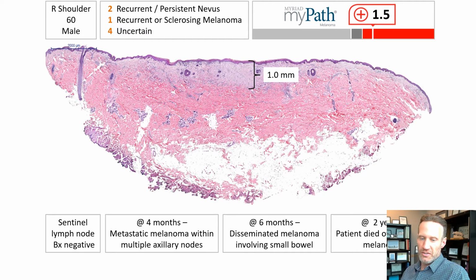And since the scar itself extended no deeper than about 1 millimeter, this appears to have been a relatively thin melanoma that unfortunately underwent metastasis and progressed to disseminated disease. So the lack of access to the prior biopsy is really what makes this a case where ancillary testing was particularly helpful, if not absolutely necessary. But cases with definitive clinical outcomes in general are also a valuable opportunity to consider some of the clinical and histopathologic clues that might at least have suggested correct interpretation.